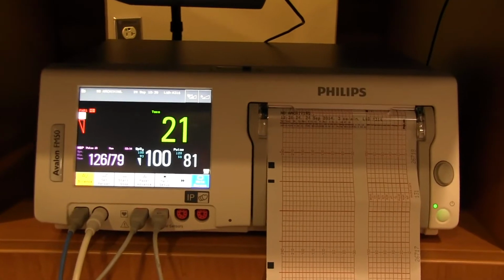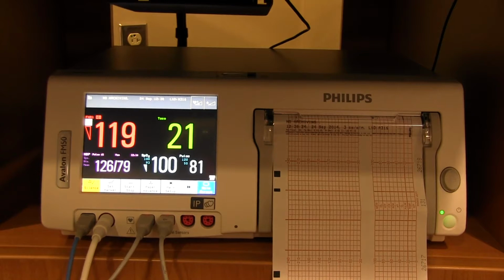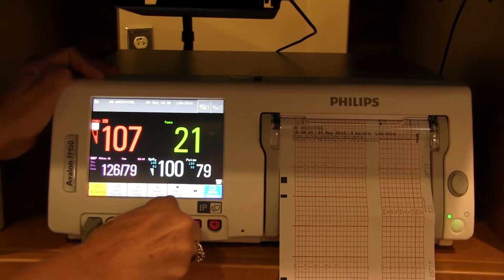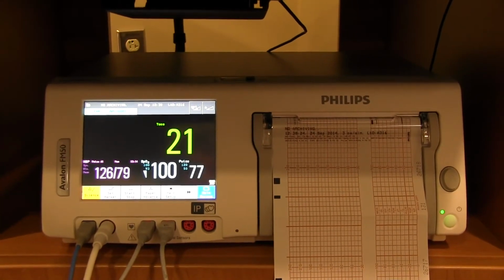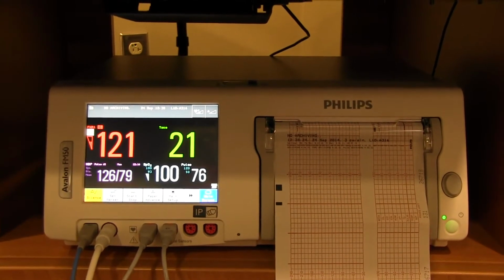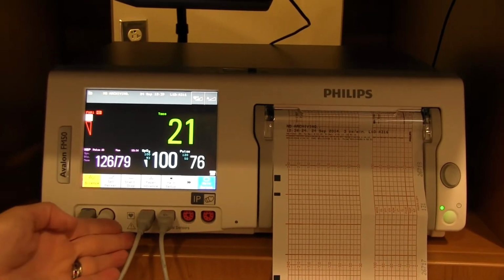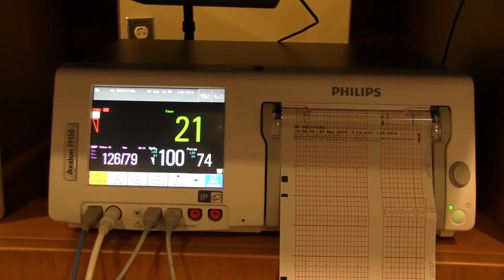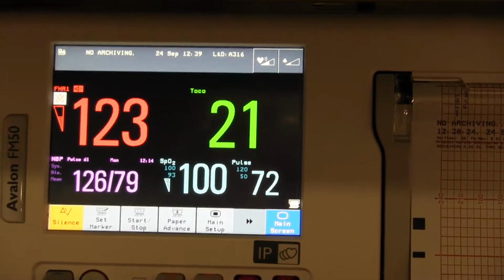Monitoring fetal heart rate by ultrasound. Place the fetal heart rate transducer into the socket. Push until you hear it click. Because of the increased sensitivity of this monitor, remember you will need to use a smaller amount of gel when you place it on the patient. Any of the 4 red ports labeled fetal sensors can be used. The first port used will show up on the monitor as FHR1, no matter which port it is plugged into.